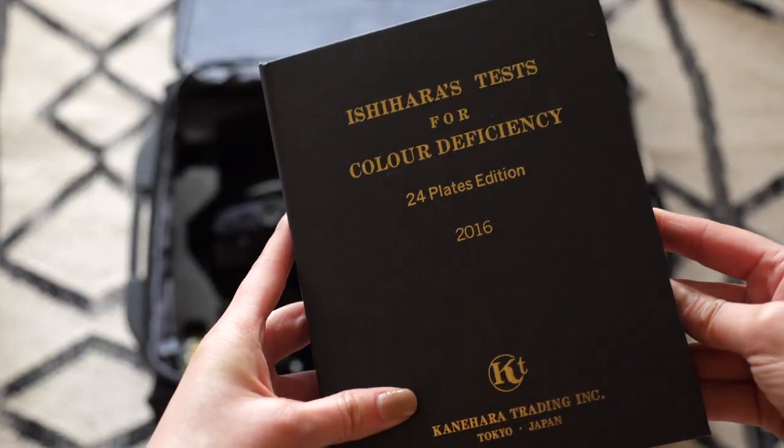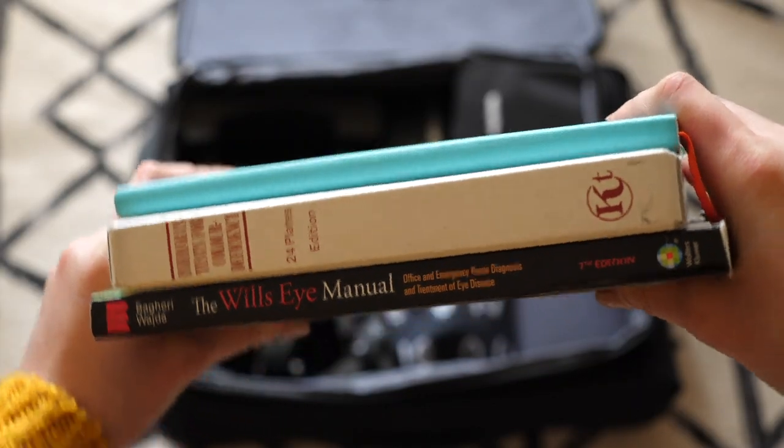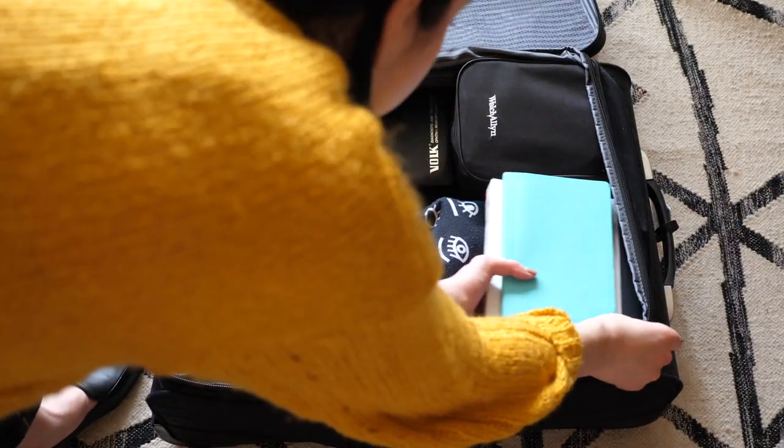Next comes things that are book-related: Ishihara, Wills Eye, patient notebooks, and stereo if I had it. They all just stack one on top of the other, and I put them right on top of my Heine diagnostic kit into the corner.